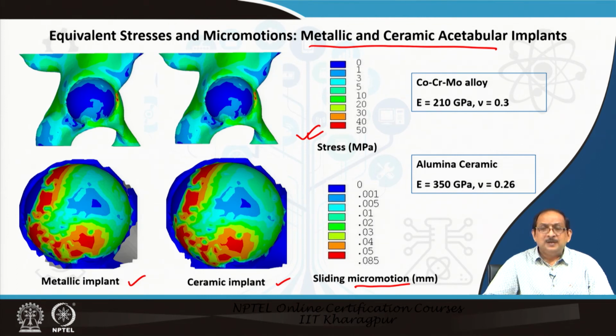So, it can be observed that the stresses as well as the sliding micromotions for both the metallic and the ceramic implants are quite similar.